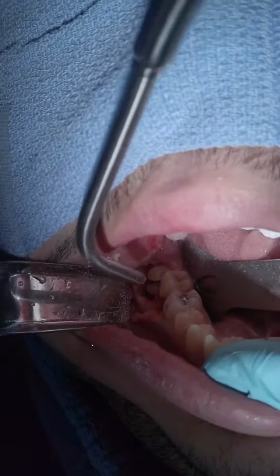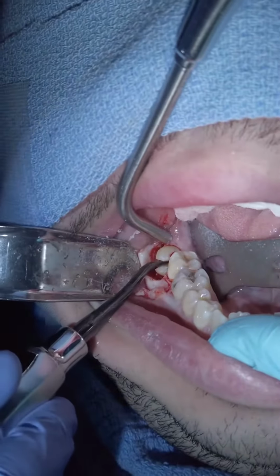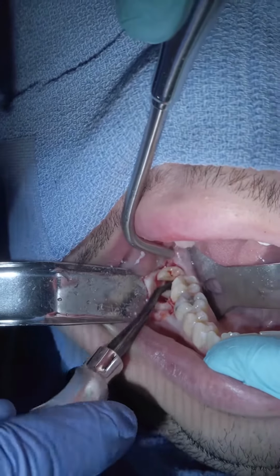Now I like to use a 77R. See that 77R? What we're going to do is put it right in there, and you're just going to twist and listen for a click. Hear that click? We're going to get that out.